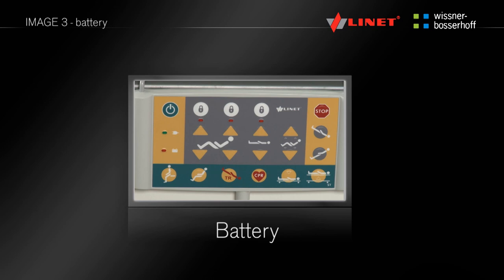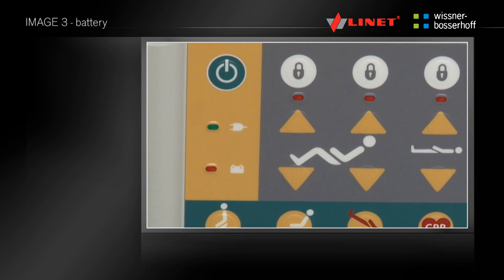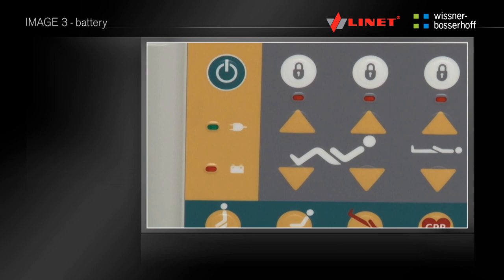The battery status is displayed by an orange indicator in the lower left corner of the supervisor control panel next to the battery icon. If the light is off, the battery is fully charged. If the indicator flashes briefly, the battery is being charged. If the indicator flashes long, the battery voltage is low and needs recharging. If the indicator lights up continuously, the battery is defective — please contact the manufacturer. The green light indicates the connection of the bed to the network.